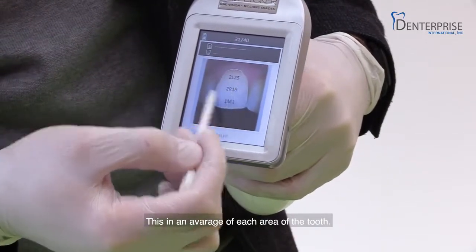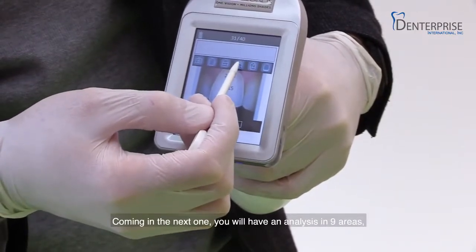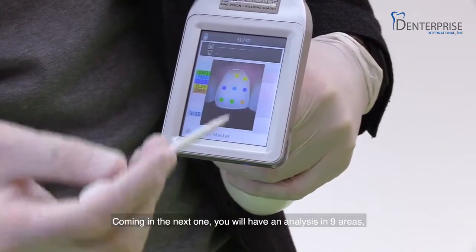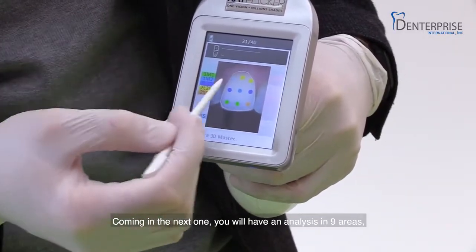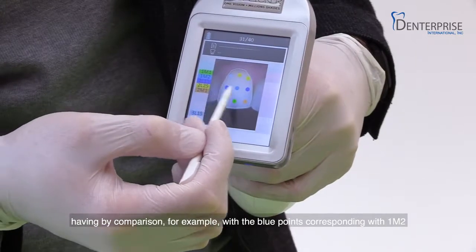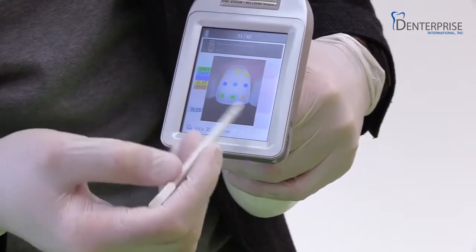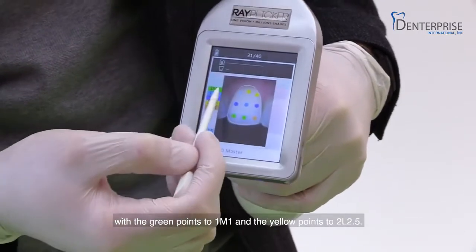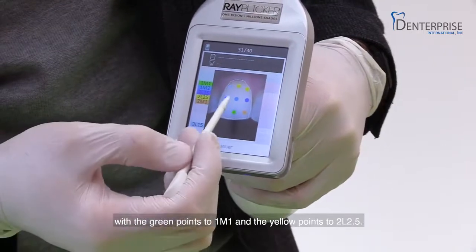This is an average on each area of the tooth. Coming in the next one, you will have an analysis in 9 areas, having, by comparison, for example, the blue points corresponding to 1M2, the green point 1M1, and the yellow point 2L2.5.